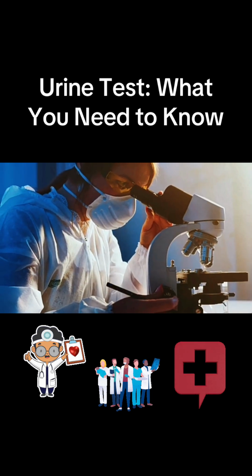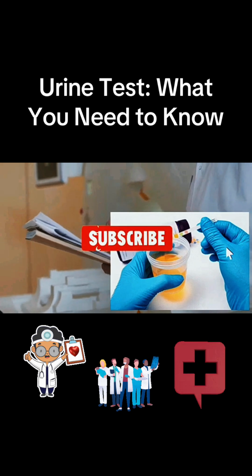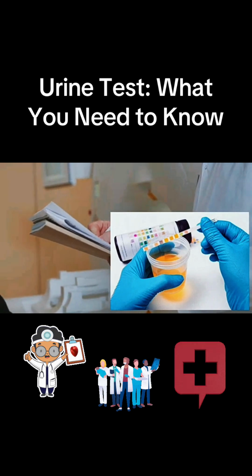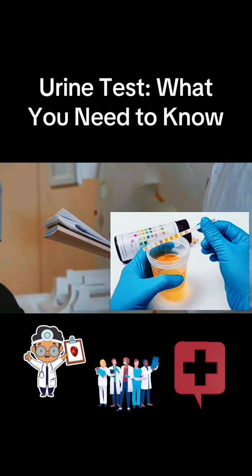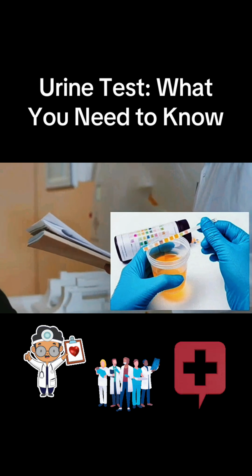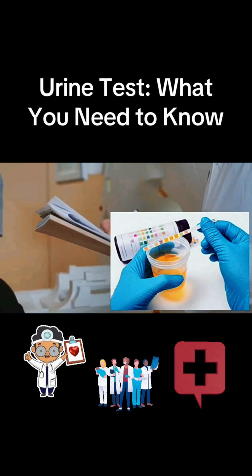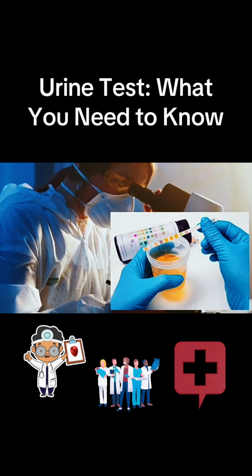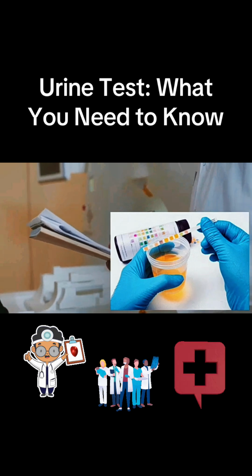Urine chemical findings. To examine the chemical aspects of a urine sample, healthcare providers or lab technicians often use special test strips called dipsticks to test for certain chemical substances in the urine sample. The strips have pads of chemicals that change color when they come in contact with specific substances. The degree of color change on the dipstick can give an estimate of the amount of substance present. For example, a slight color change in the test pad for protein may indicate a small amount of protein present in the urine sample, whereas a deep color change may indicate a large amount.